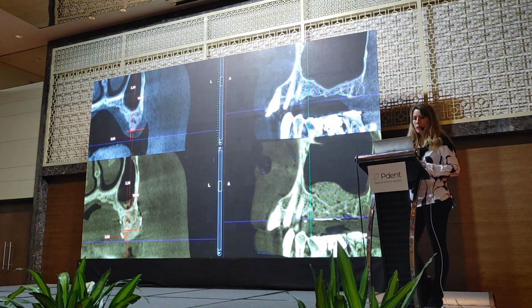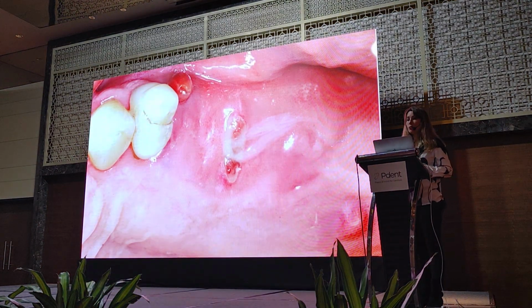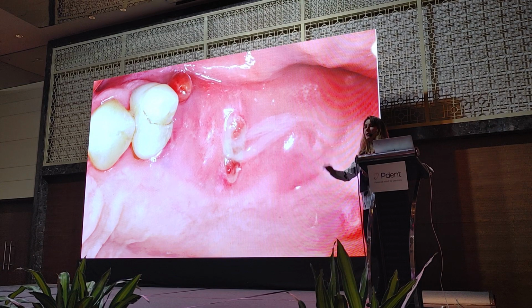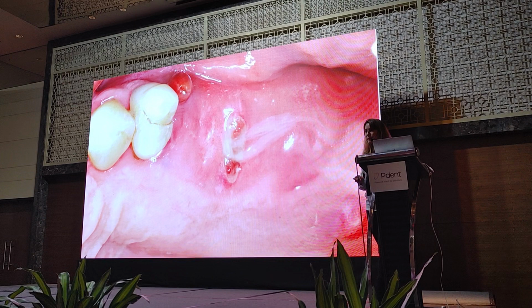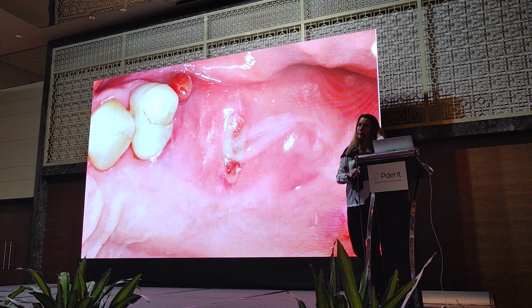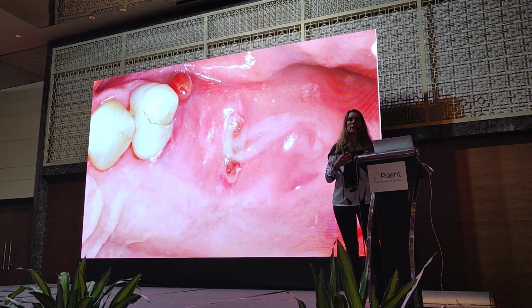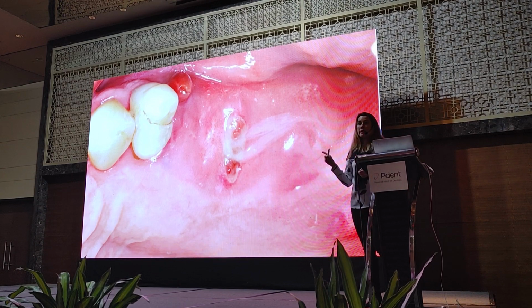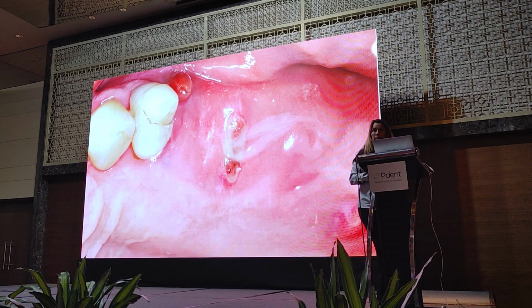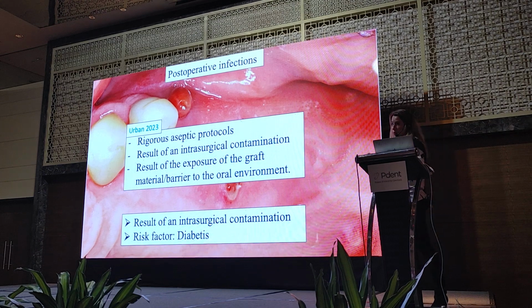So this is the postoperative CBCT. And I told the patient, oh, now it's good, see you in 2 months. This is how I came back. He didn't feel anything, no pain, no problem. He didn't understand why I was like, there's a problem. And so this is 2.5 months after the surgery. So this is a post-operative infection.